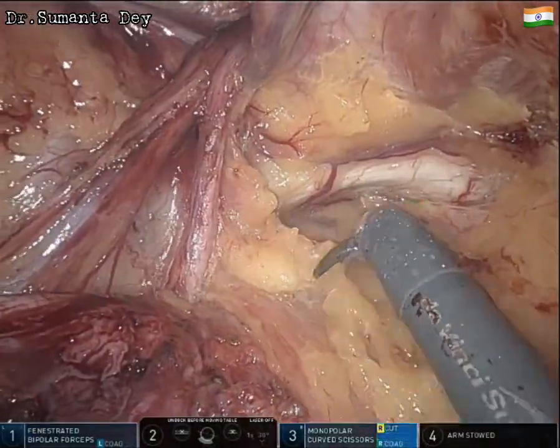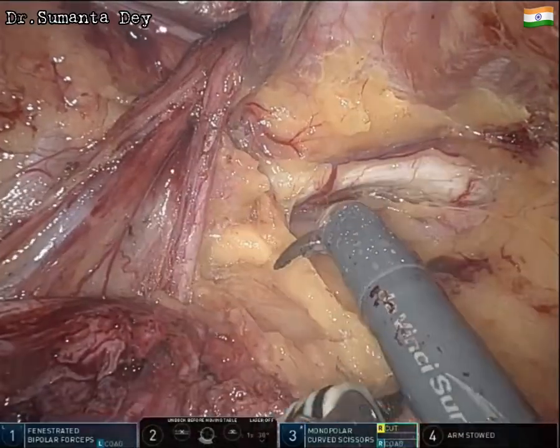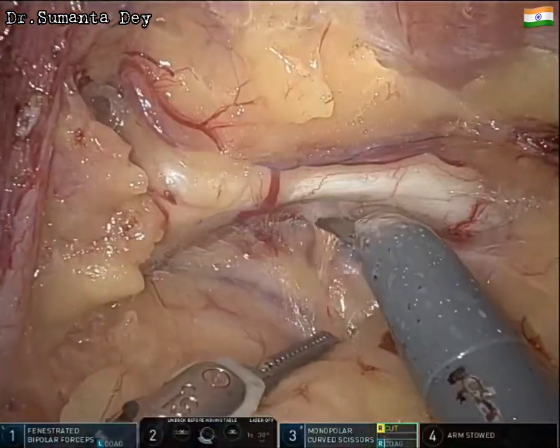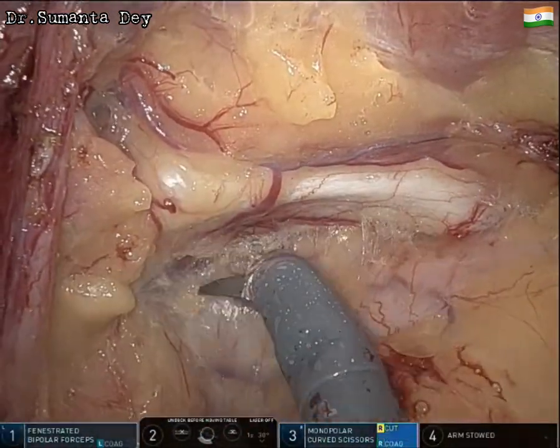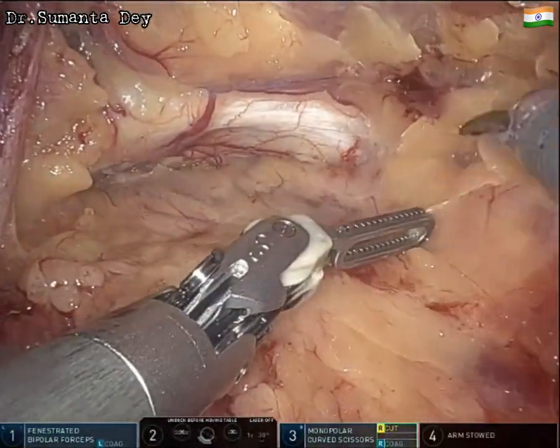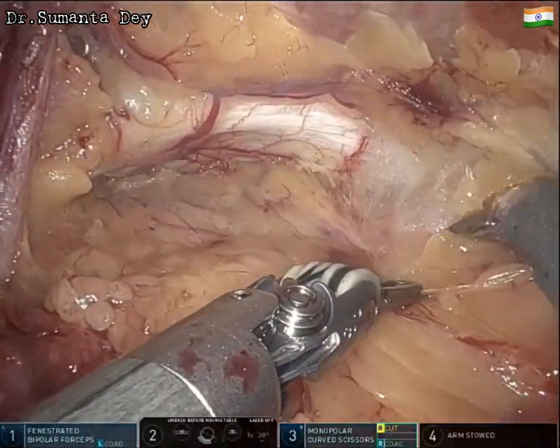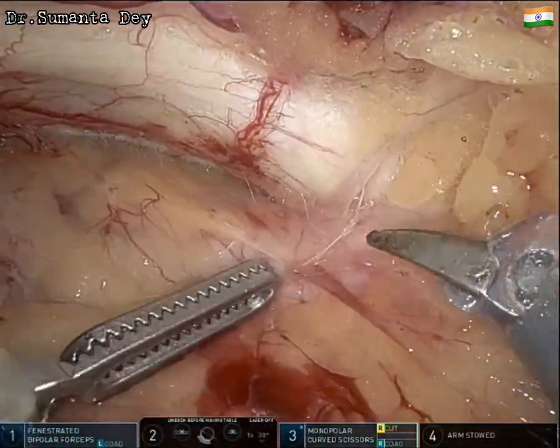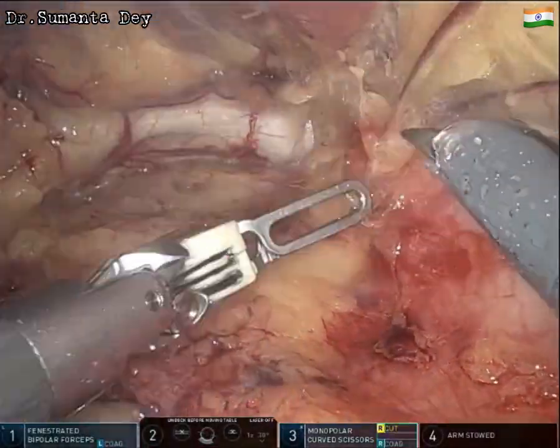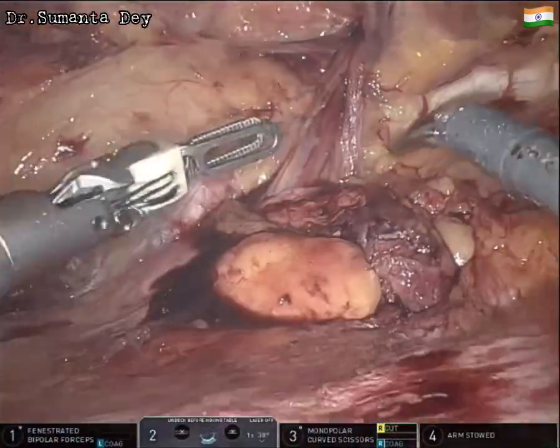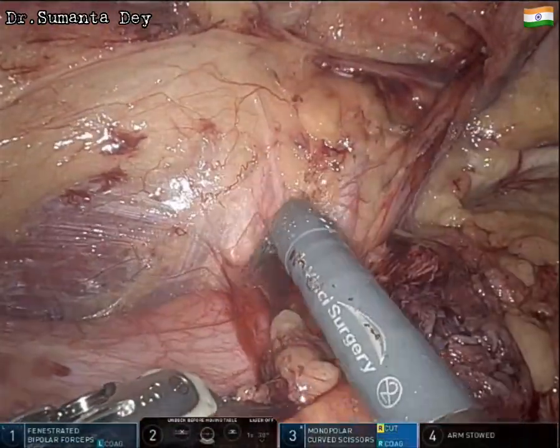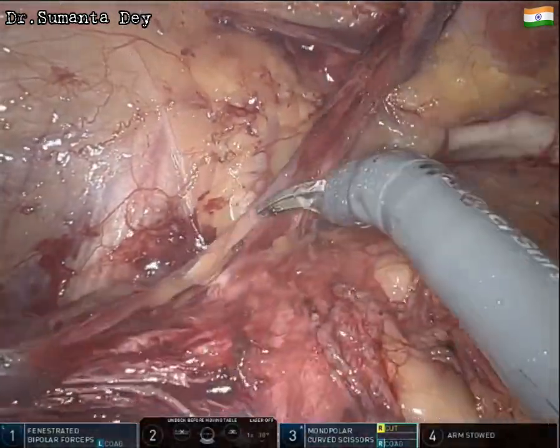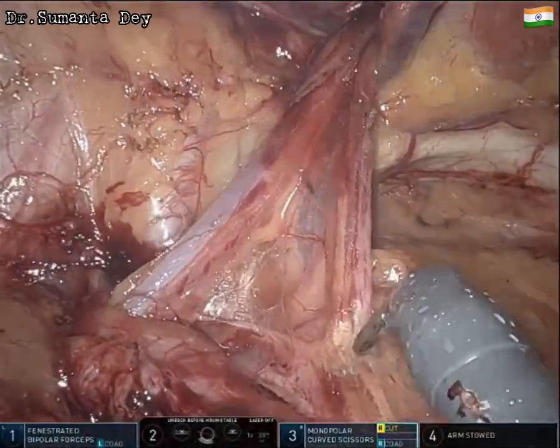With gentle energy application and traction/counter-traction, the space of Retzius — between the pubic rami and the urinary bladder — is nicely exposed. To achieve the critical view of safety, dissection must cross at least two centimeters beyond the midline past the symphysis pubis. Laterally, the psoas muscle and pulsation of the external iliac artery and vein are visible.